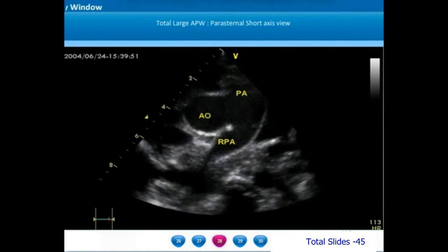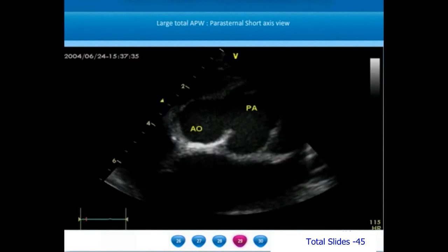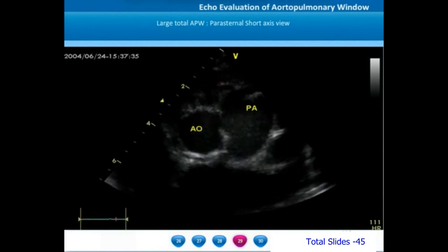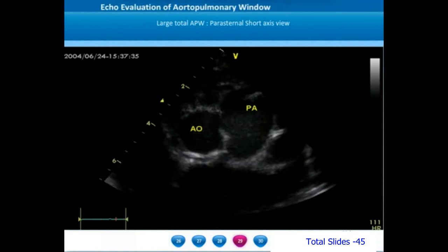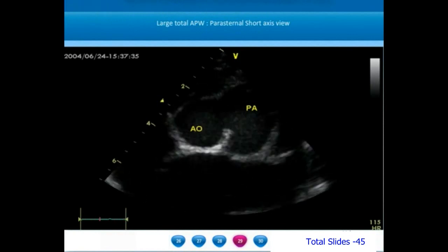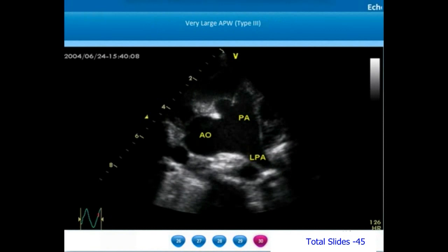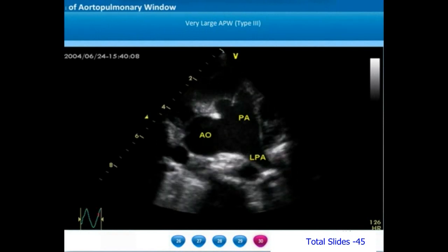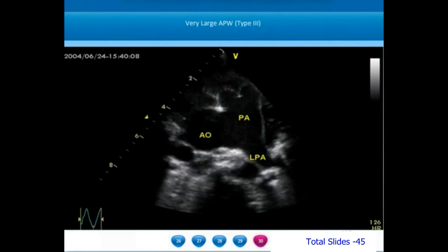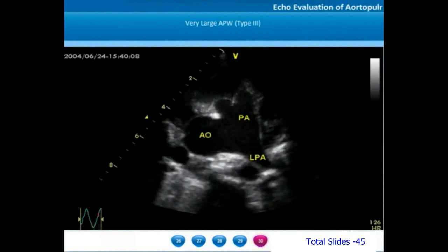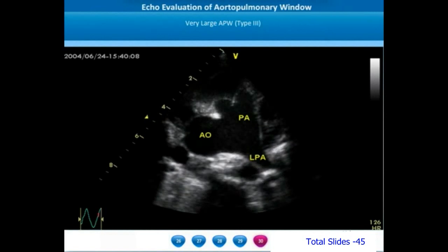On parasternal short axis view of this large AP window, the pulmonary artery bifurcation and right pulmonary artery origin are seen, and almost up to this level there is a large AP window — such extensive AP windows are called total AP windows. Another parasternal short axis view shows an extremely large AP window starting from the proximal main pulmonary artery and extending almost up to the pulmonary artery bifurcation. We also notice that the ascending aorta is significantly dilated — ascending aortic dilatation is a characteristic feature of large AP windows.